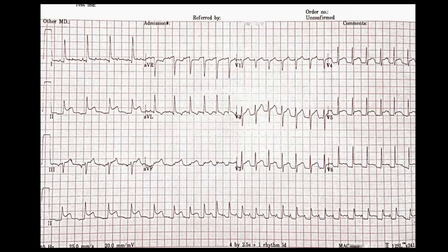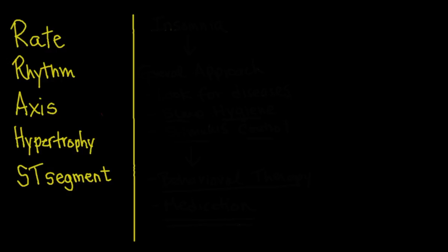What we're going to do here is go through our methodical method of interpreting EKGs so we can pick up all of these things and make a diagnosis. We'll go through this order: rate, rhythm, axis, hypertrophy, and looking at ST segments.